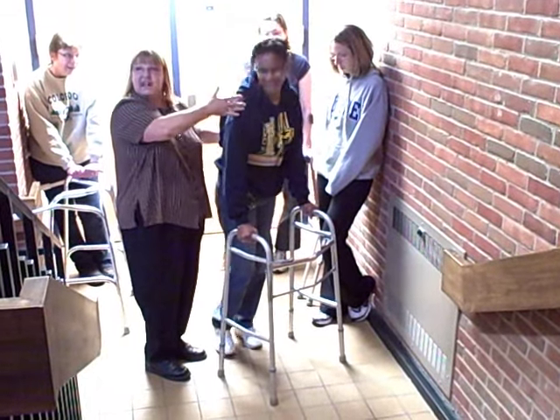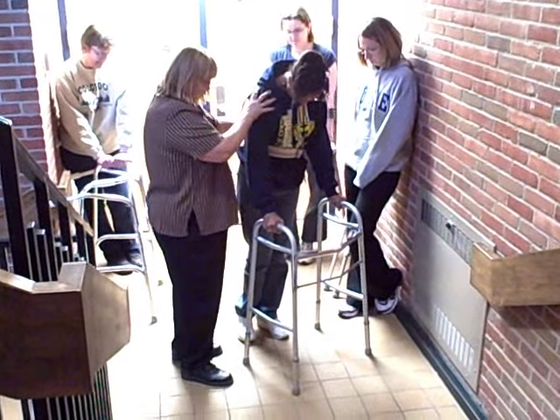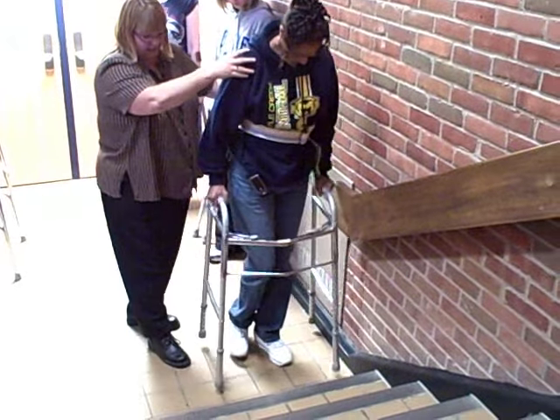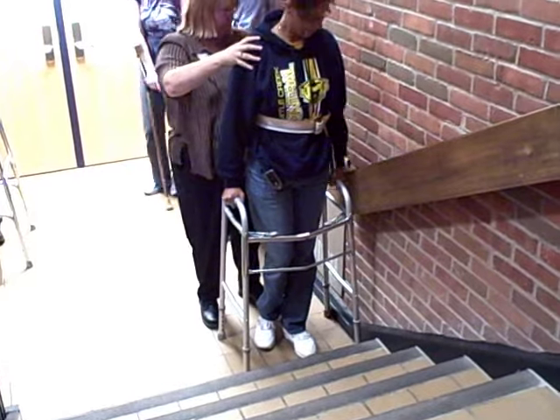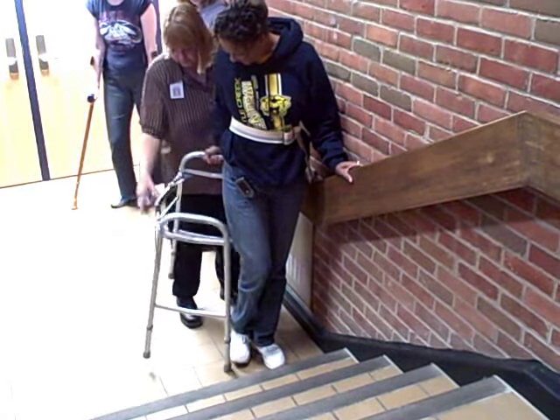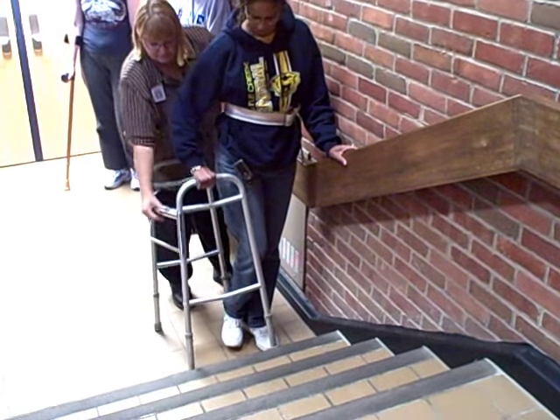I used my upper hand to stop her there. Keep that one right up off the ground, and then step forward with your left foot — just go ahead and fold it, there you go. Now what you're going to do is use your left hand on the rail — we're going to grab that. This hand is going to bring the walker around, just run it to the side.